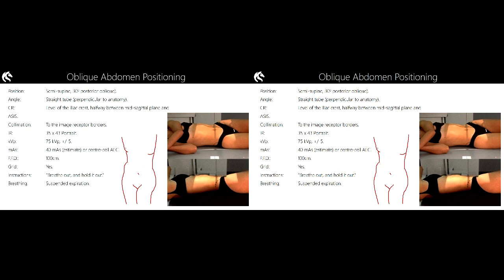Wow, this is really easy to draw without the line showing up. That's great. All right. So, a bit of a rough drawing. It's actually kind of hard to use this tool, I must say. So let's imagine that the patient is in an RPO 30. Wow, that makes me look super drunk.